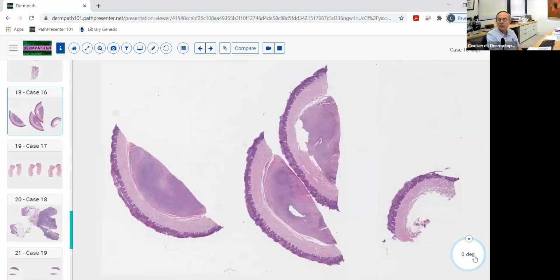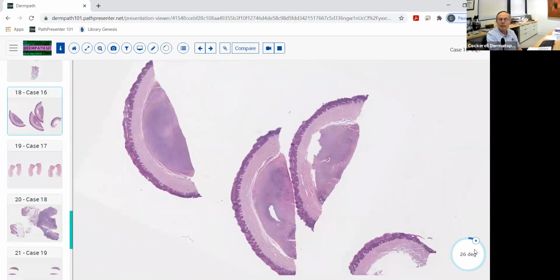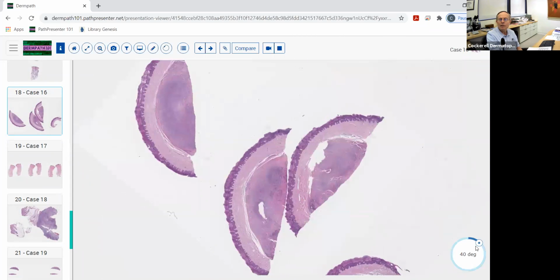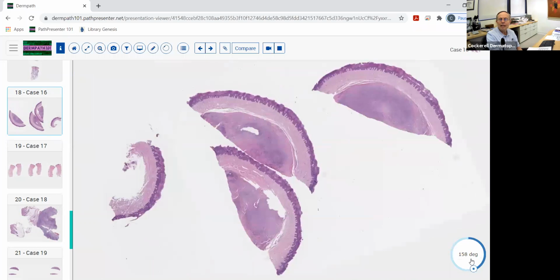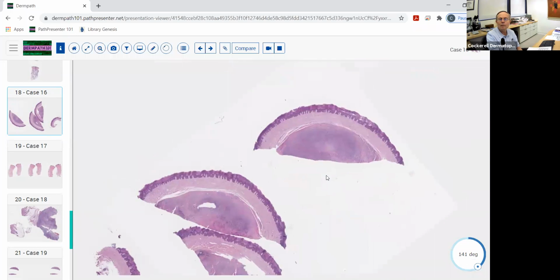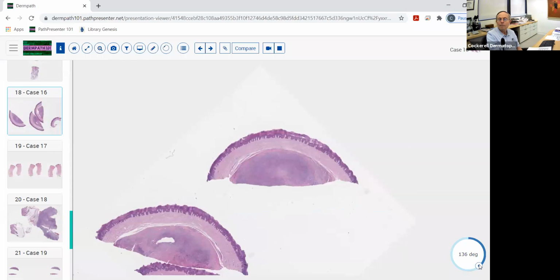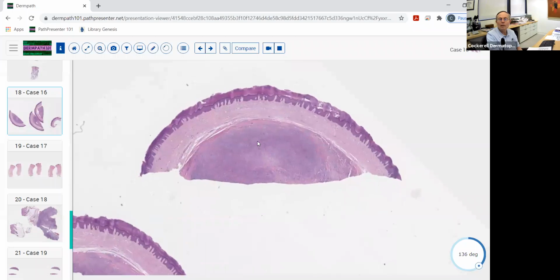Okay, this is another lesion from near volar skin, and they were actually able to get this on a shave biopsy. A lot of times you can't because these things are situated more deeply. Look at this piece over here. So again, notice that the epidermis is normal. This is a dermal-based nodule.